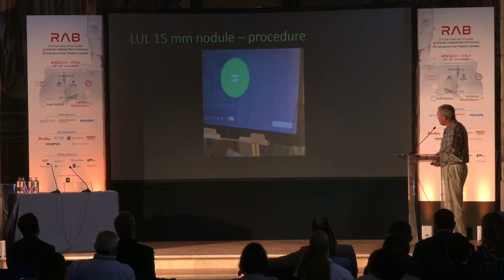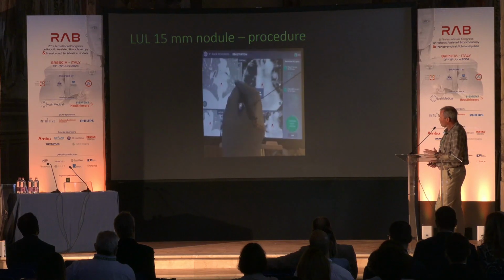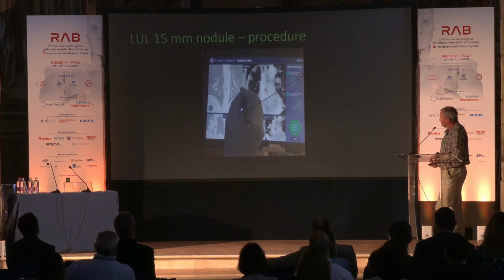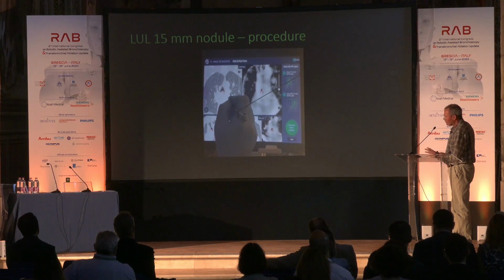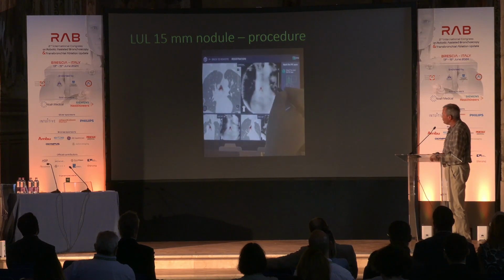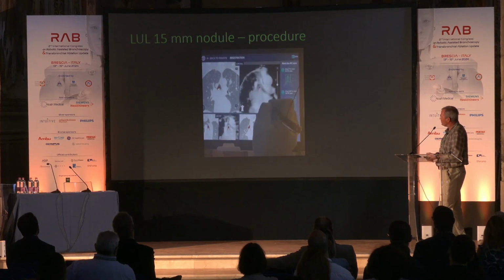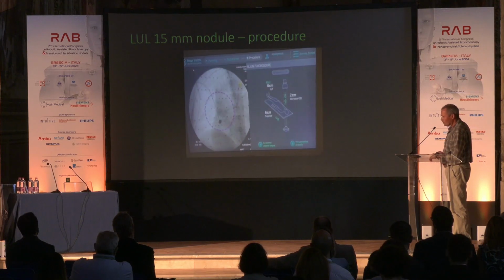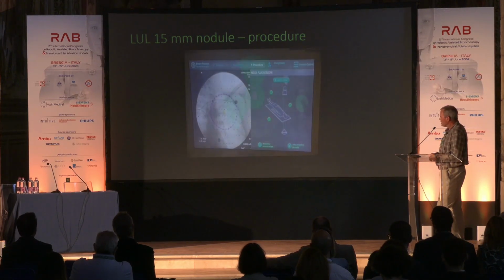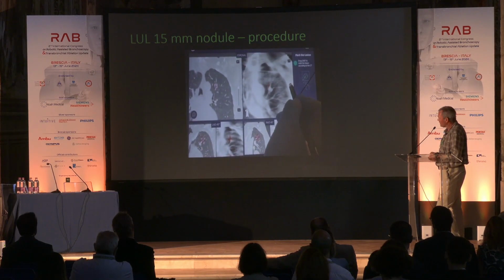And then, this is the actual bronchoscopy. What you saw before, we could have done a few days before. You have to center the system with the patient. So what you do is a spin around the carina. You mark the carina on the CT to feed into the system, and then you mark the carina on the CBCT reconstruction of the system, and then the system tells you how to center the nodule in the middle of the C-arm spin. And then you do another spin which takes about 14, 15 seconds.